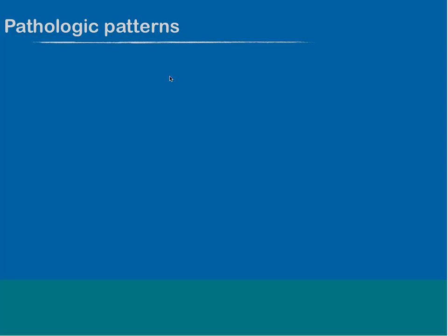Pathologic patterns which we can observe: you all know root rests, which you have to avoid for putting in implants there. Could be very deteriorating. We have a lot of cemento-osseous changes. I will show you some case of cemento-osseous dysplasia, where you don't know what kind of, let's say, biomechanical characteristics the bone has.